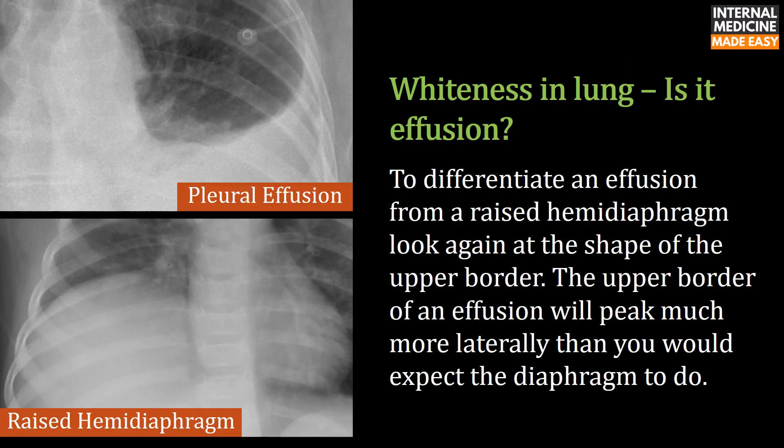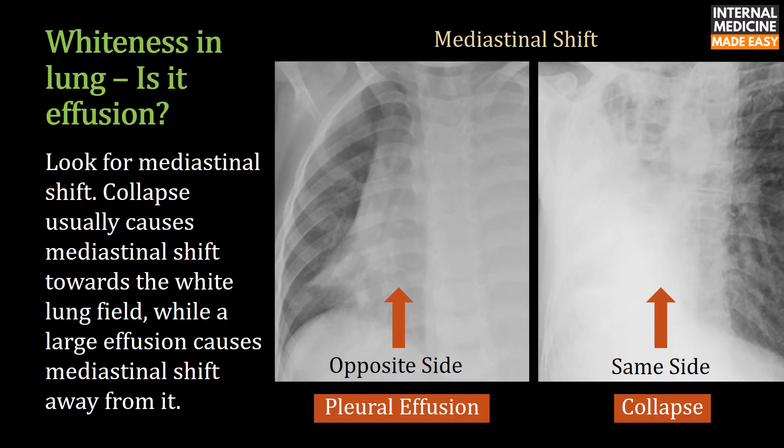To differentiate an effusion from a raised hemidiaphragm, look again at the shape of the upper border — the upper border of an effusion will peak much more laterally than you would expect the diaphragm to do. Also look for mediastinal shift: collapse usually causes mediastinal shift towards the white lung field, while a large effusion causes mediastinal shift away from it.